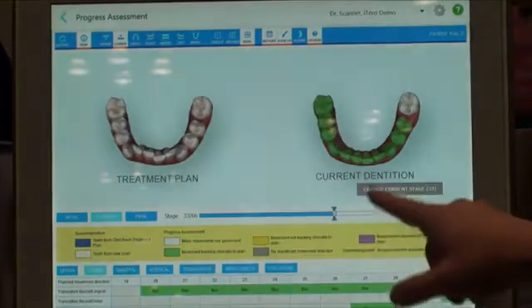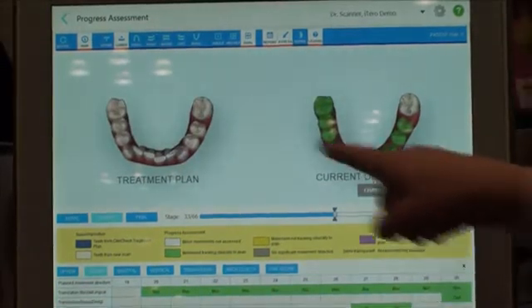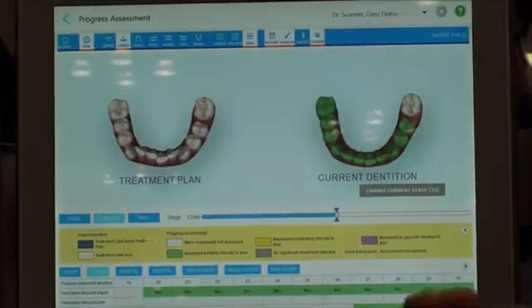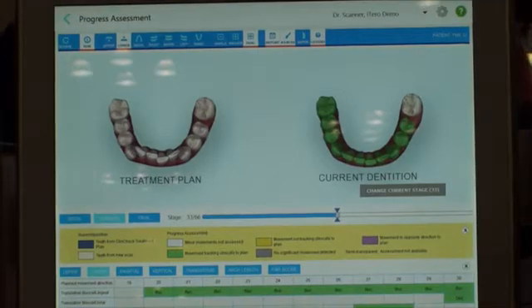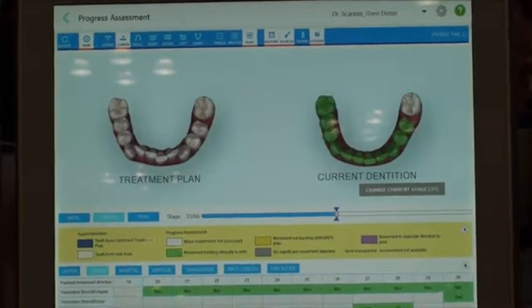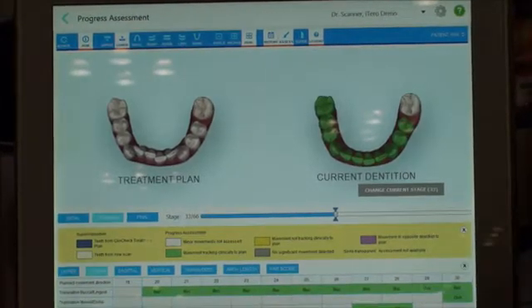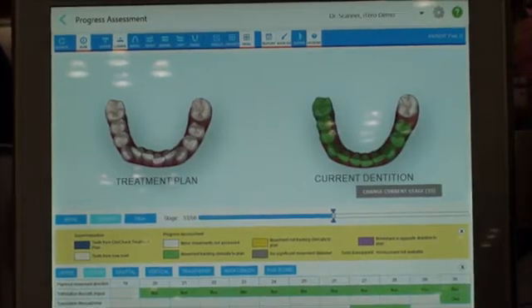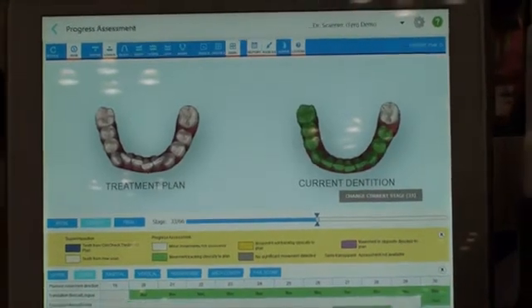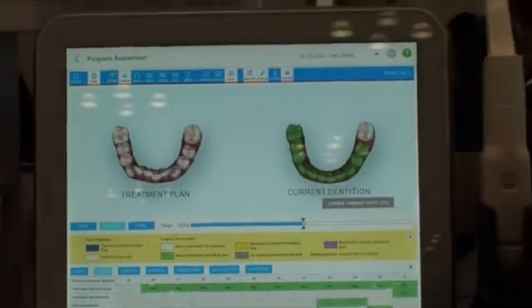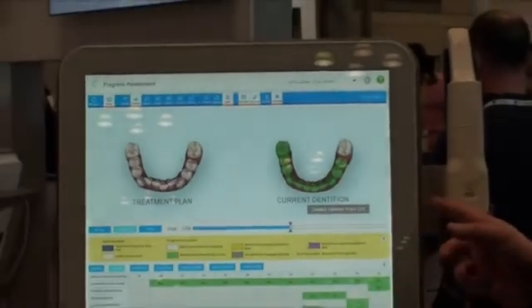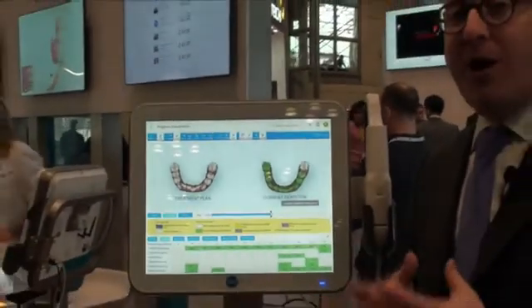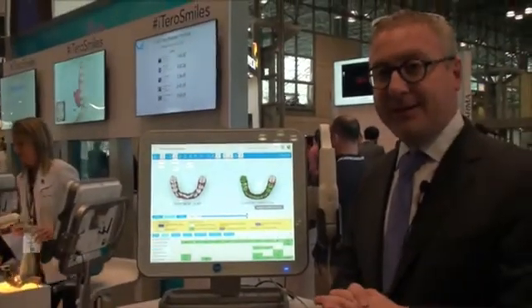Here we have the lower arch at stage 33 — it's perfect, exactly where we want to be. So now every dentist knows exactly where they are at every single step along the way with Invisalign. Even if you're not orthodontically trained, if you're using the Invisalign system in combination with the iTero Element, it will tell you where you are every step of the way in the case.